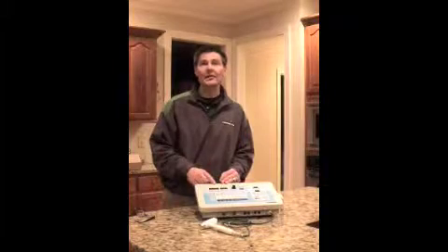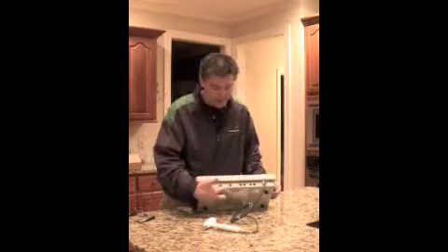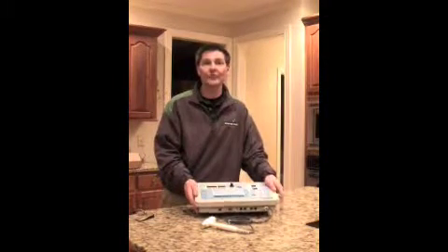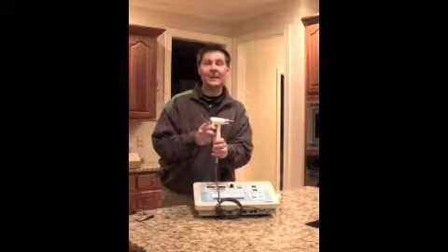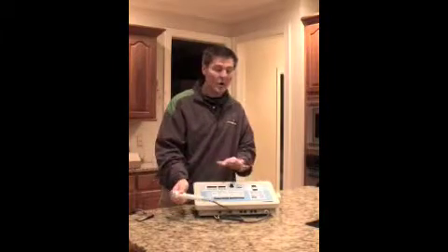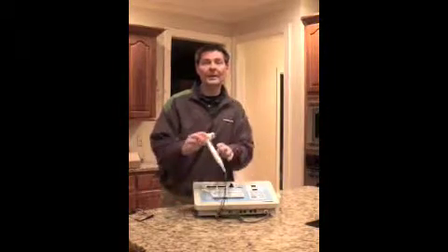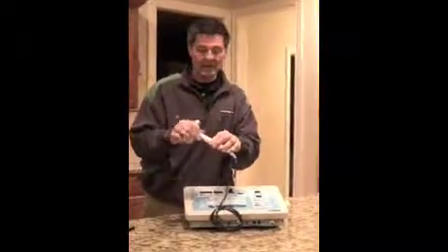You can tell from the front whether there are two sets of channels or four. This is actually a two-channel combination unit with a two-centimeter and a five-centimeter ultrasound transducer. All variations of stim can be delivered via either one of these transducer heads.